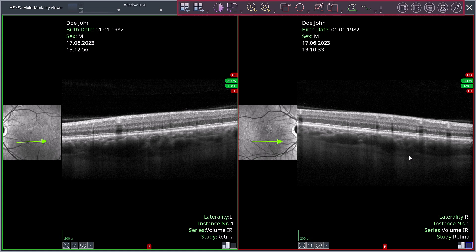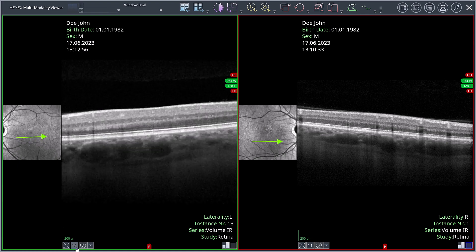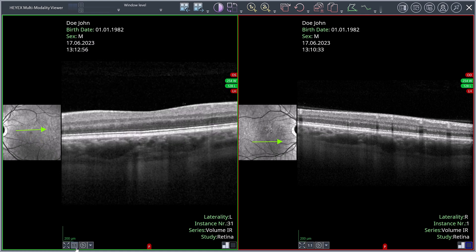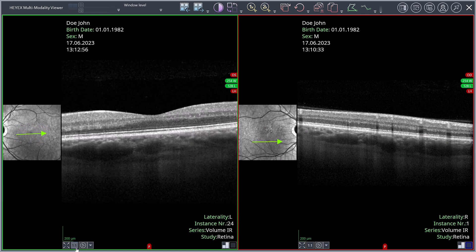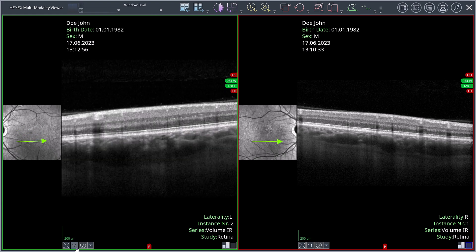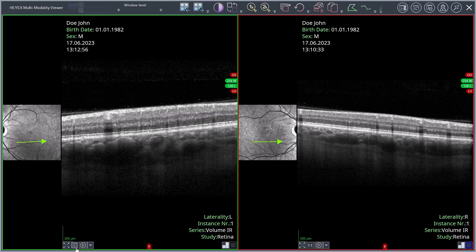The ribbon bar is located at the top, with the viewport containing the selected scans or images below. The green frame shows the active viewport, where you can zoom and scroll through the individual OCT section images. To navigate through several images at the same time, click the red framed inactive viewports while holding the control key.